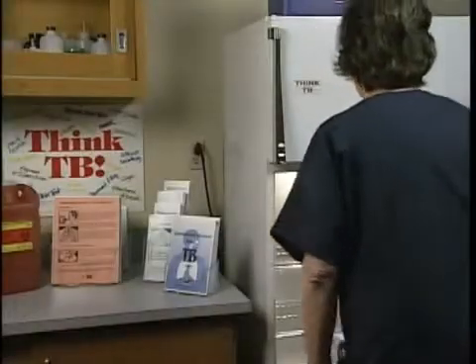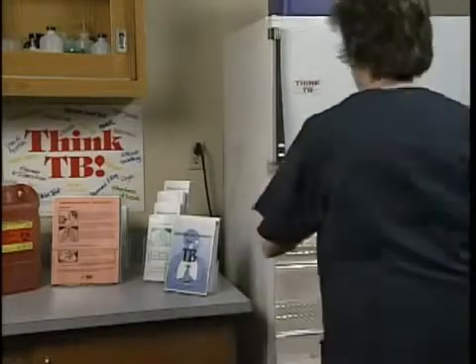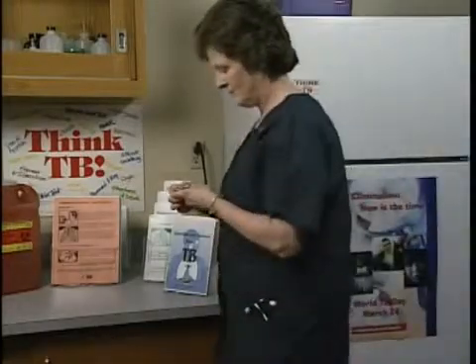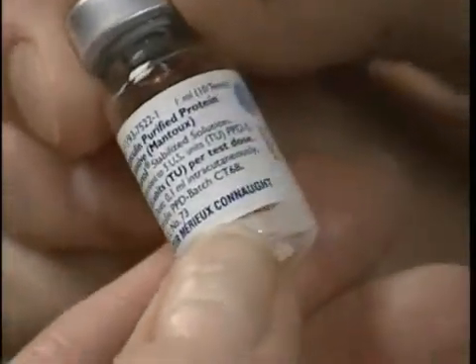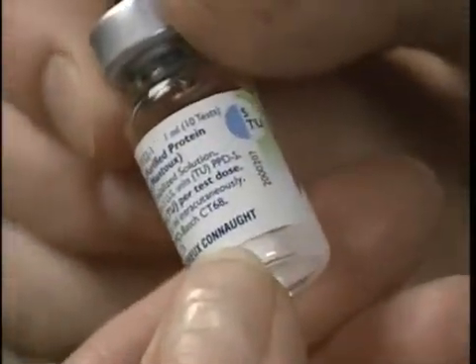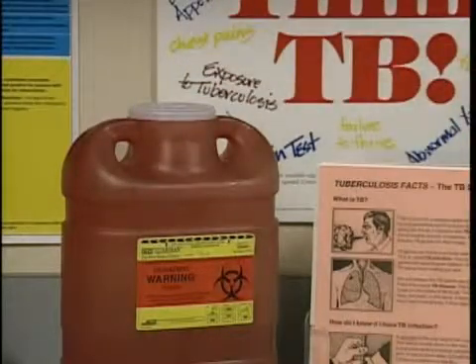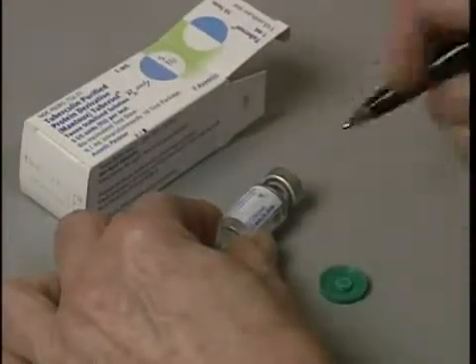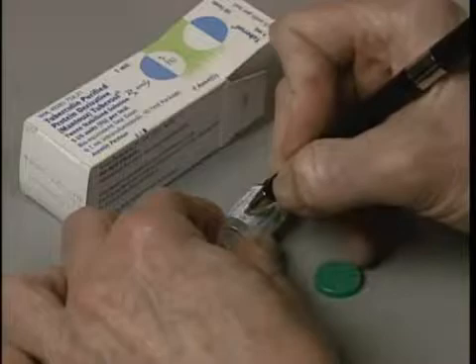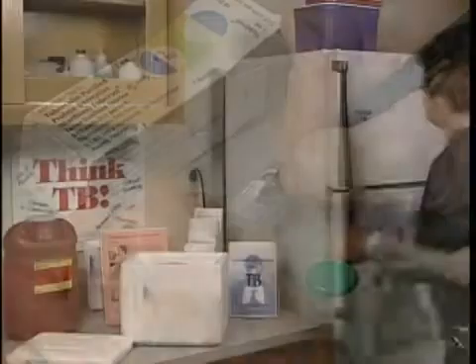Look at the vial label to make sure the vial contains the tuberculin that you want to use, including the tuberculin unit strength. The label should indicate the expiration date. If it's been open more than 30 days or the expiration date has passed, the vial should be thrown away and a new vial used. When you open a new vial, write the date and your initials on the label to indicate when the vial was opened and who opened it.